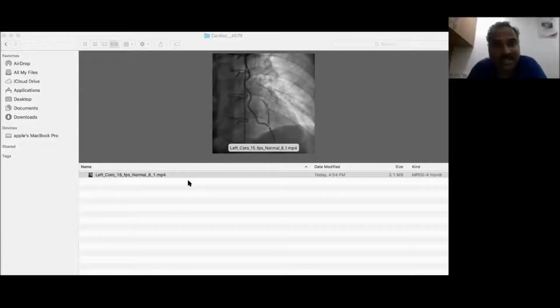Once I kept a stent, this is post stenting. So I kept a stent. Yeah, this is the first one. Can you see? Now the distal lesion is gone at the anastomosis. Can you see another lesion at the proximal end of the stent? Hope you are able to appreciate.